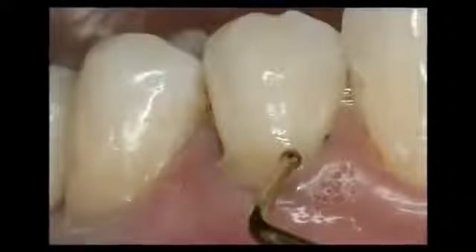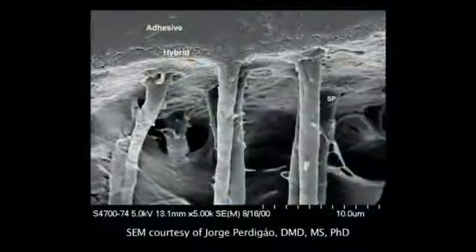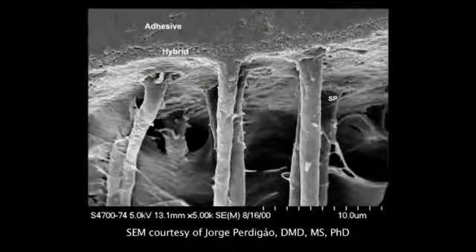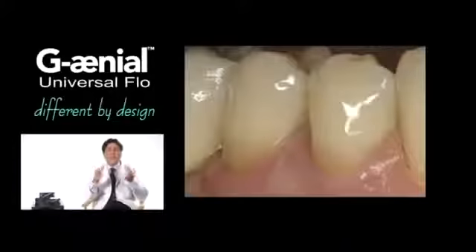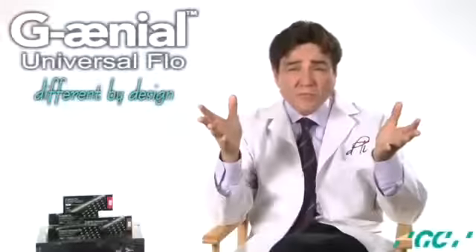This procedure reduces sensitivity with application of a dentin adhesive and flowable composite to form a hybrid layer, and this resin barrier prevents continued diffusion of toxins and bacterial invasion toward the pulp while producing minimal adverse pulpal inflammation.